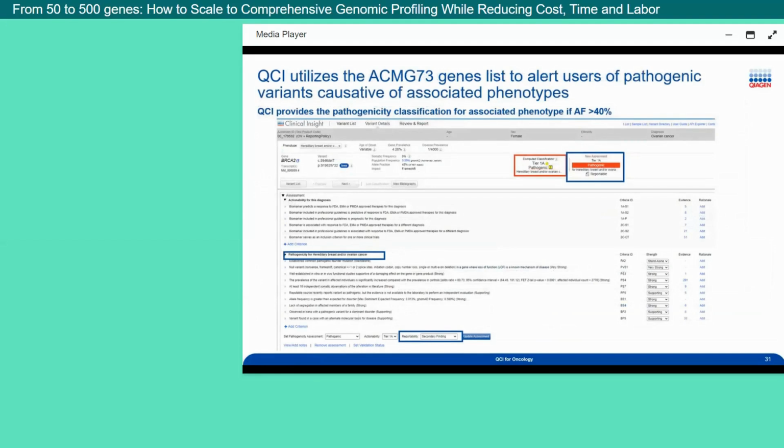Now, you may have noticed the relatively high gnomAD frequency in the header, and it's particularly high in the Ashkenazi Jewish population. Reviewing the ACMG criteria shows that it's indeed an established common pathogenic founder mutation. The transparency in the ACMG criteria allows the user to quickly review all the evidence to determine a potential causative relationship to ovarian cancer.